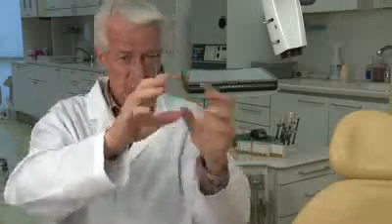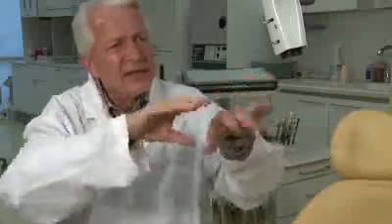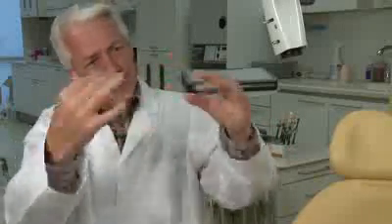to move to something that would be more opacious than a mist and describe a more opacious enamel in a body form, not an incisal edge form, we came up with a moderately translucent, moderately opaque term by putting pearl and frost together. We've all seen the frost out on the lawn, out on the grass, and it's semi-opaque, semi-translucent. And it certainly sounds more pleasing than a pearl fog, too close to smog, if you will. So that was our next gradation.